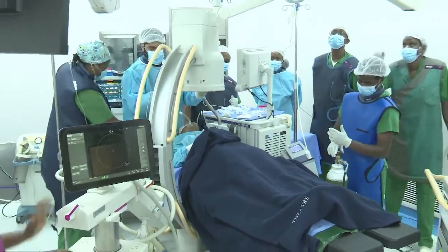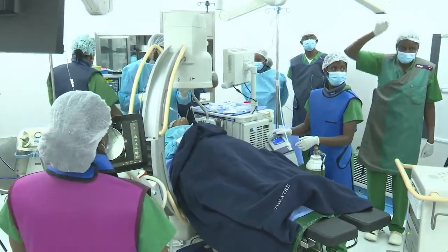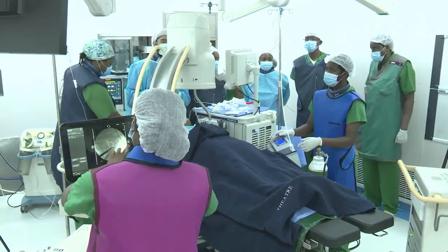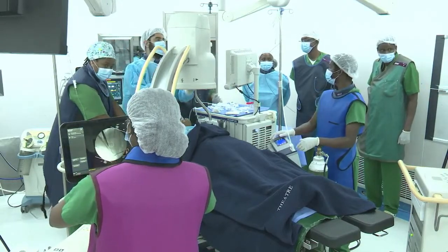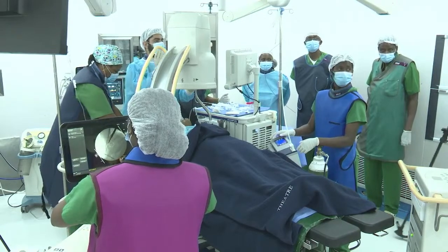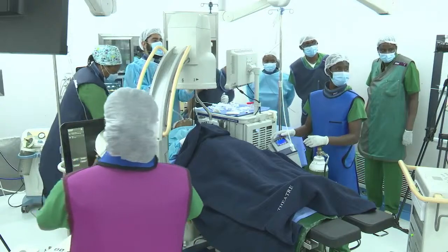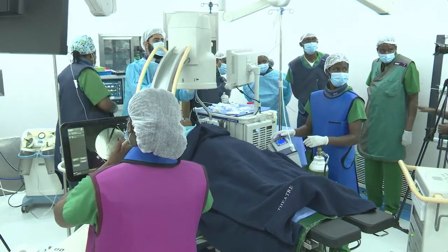Okay, good. Give me a test image. There's a fellow there. He needs to be outside. Yeah, good. Now, no, make it a bit straighter. Turn it anti-clockwise, like 10 degrees. A little more clockwise now. Yeah, that's okay. All right.